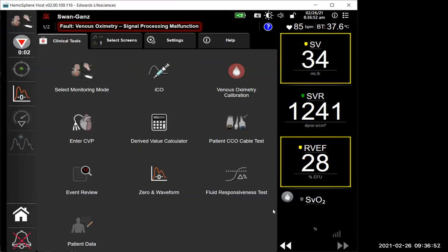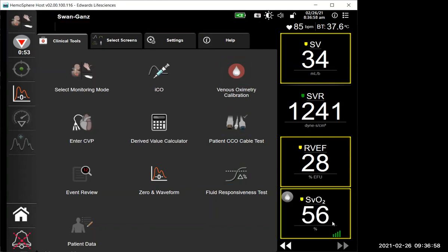So your value should pop up in this SVO2 as long as you have it pulled up. So there you go. In the bars now, so before on your monitor, it was like 1 box was a great signal and 4 it turns red, it's a bad signal. So it's more like a cell phone now. So like this is the best signal you're going to get. You'll have fewer bars, and I believe it'll go yellow and red if you don't have as many.